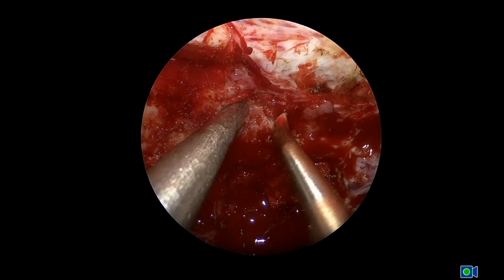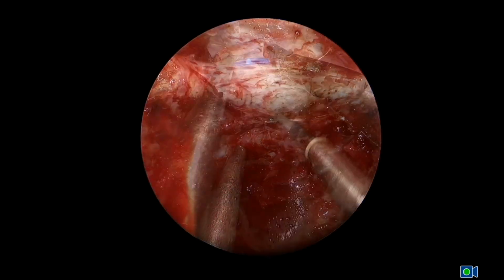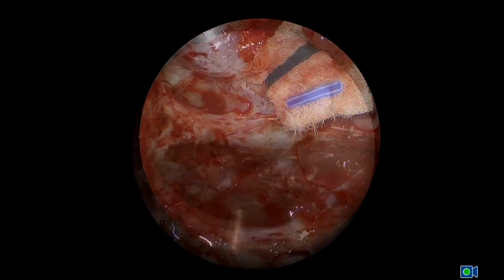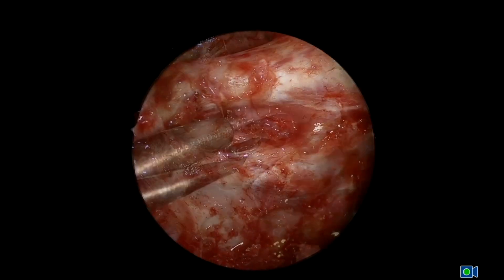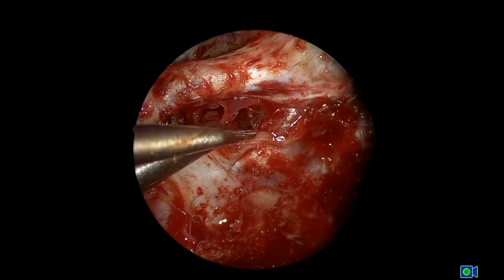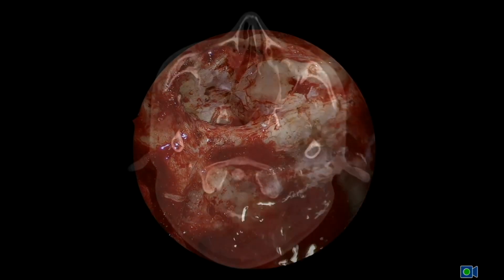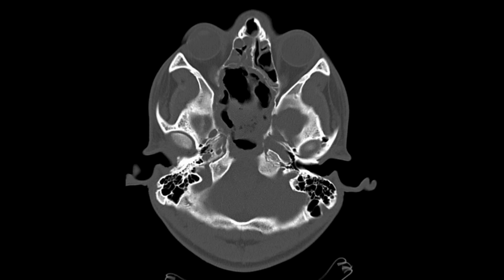And this is some tumor left at the clinoidal area on the patient's right side. We see the optic nerve nicely exposed, the dura pulsating on the planum sphenoidale, the cavity created by the tumor. This is some of the optic strut that is left. You can see we are working lateral to the clinoidal carotid, and we are emptying this optic strut to make sure there is no residual tumor left. So we finally accomplished a complete tumor resection.